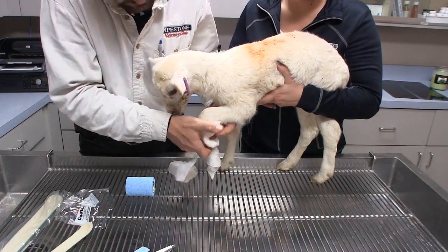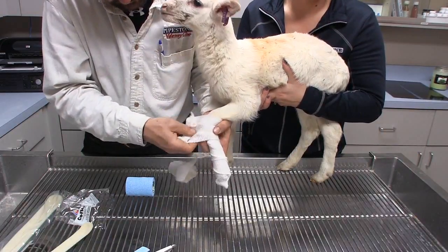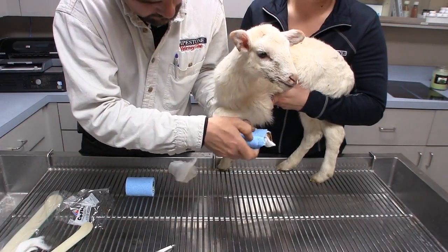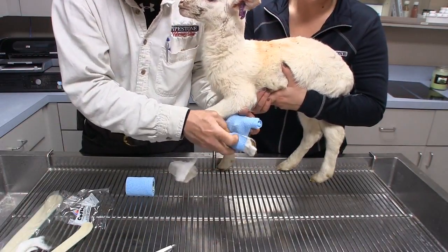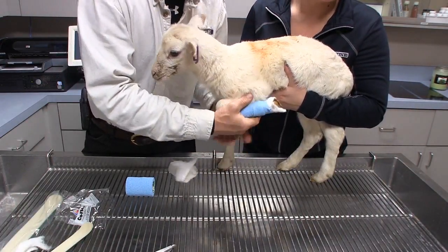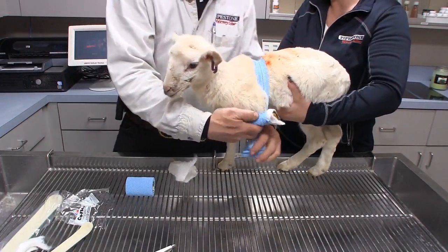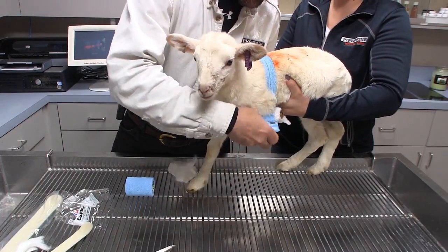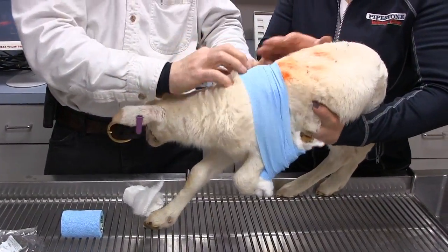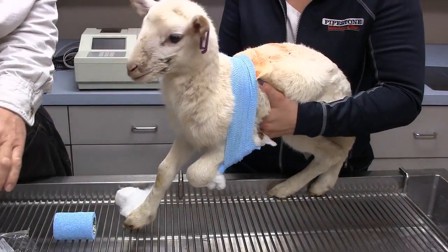The second video segment is to demonstrate how we would immobilize a fractured front leg above the knee or carpus. So again, we're going to pad the skin with cast padding, which is just some cotton. Then we're going to use vet wrap on the lower part of the leg, the non-fractured portion, and we're going to wrap the leg up against the body. Right here we're actually going around the leg and then behind the elbow, back around the lamb, and we're securing with tension the leg up against the body.